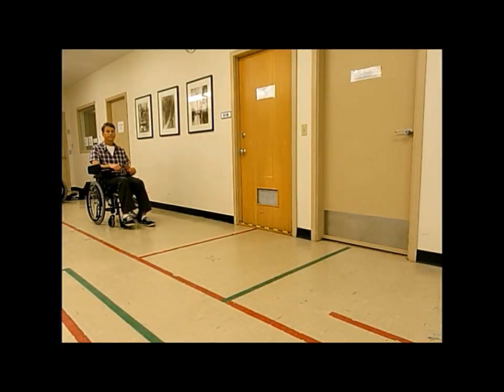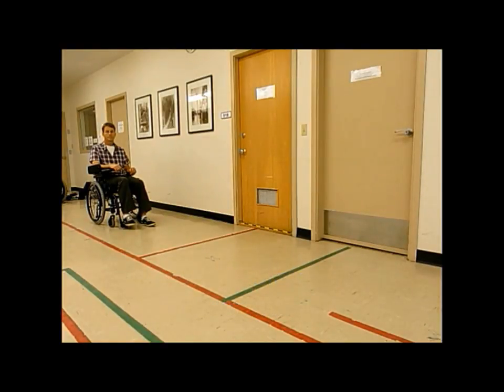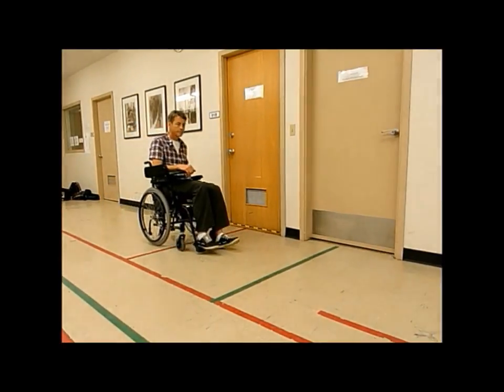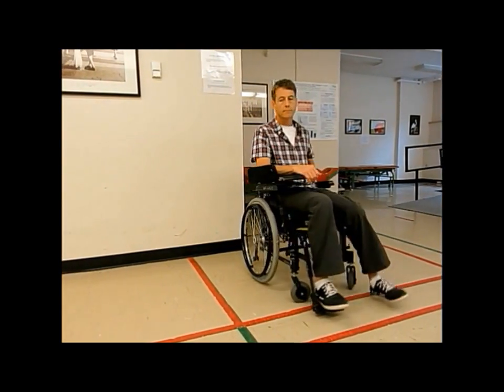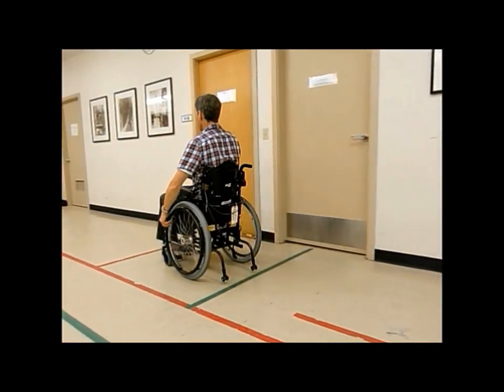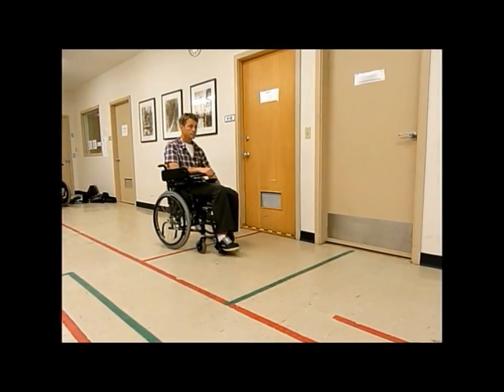For your observations and documentation, what are the goals for mobility? For example, is it wheeling around the unit indoors on level surfaces? Or is it going to the coffee shop that involves going outside and on uneven ground? How far and how long can the client wheel for? Do they have decreased sensation? And where are the pressure points and shearing when wheeling? Is propelling increasing their tone or pain? Is propelling feeding into their stroke presentation? Do they have inattention to one side?